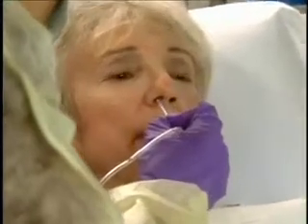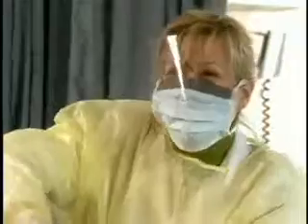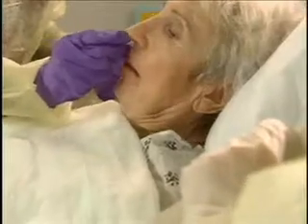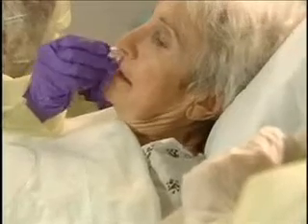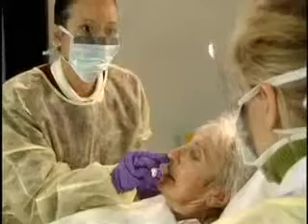You're going to feel a little pressure. Just try to relax. Okay, you're doing great. You know this. Just keep the Y port open during insertion. The catheter should slip along the floor of the nostril toward the trachea to suction the nasopharynx. Okay, I've reached the predetermined distance.